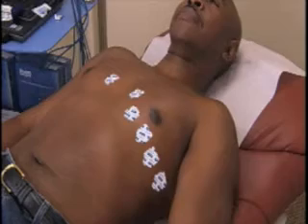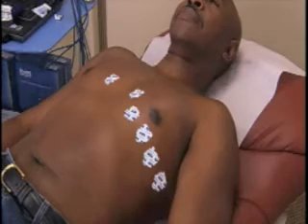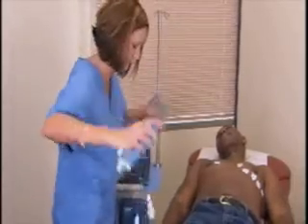Serial comparison allows you to compare up to four ECGs for the same patient by clicking on the serial comparison button.